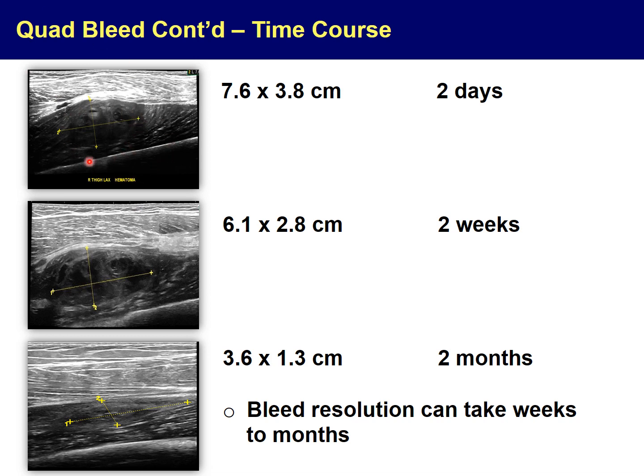Please also note that although these 2 images look almost as if this hematoma was larger than this one, both images are taken at a different depth and zoom, and this explains the almost similar appearance. However, when measured, this is clearly smaller than this.